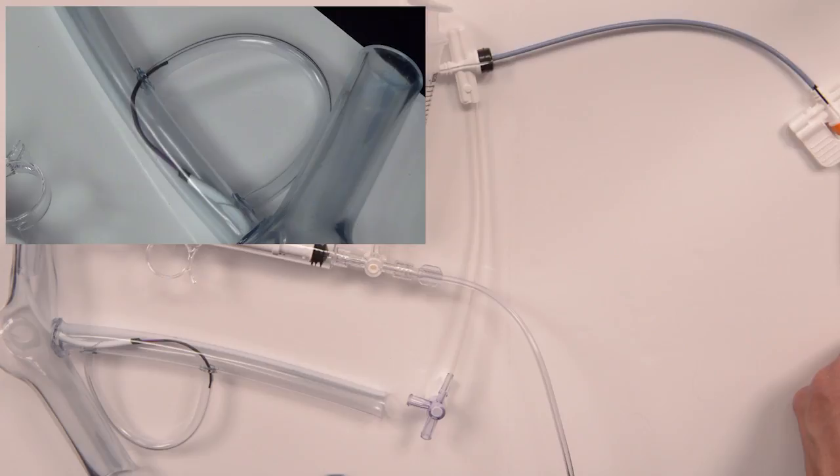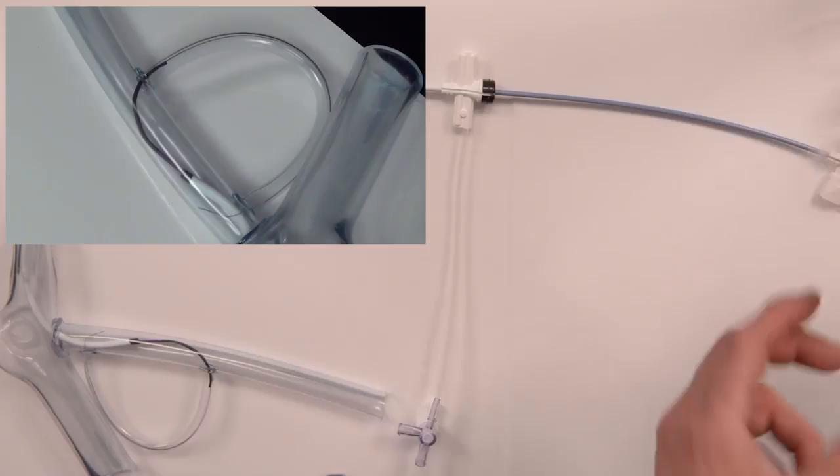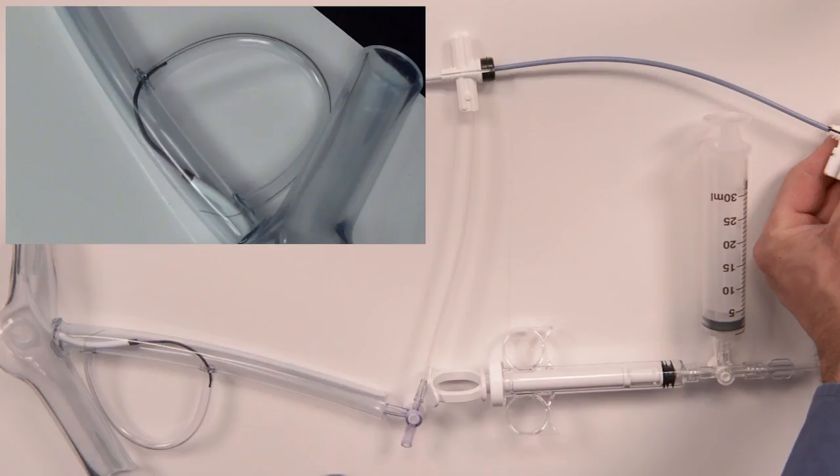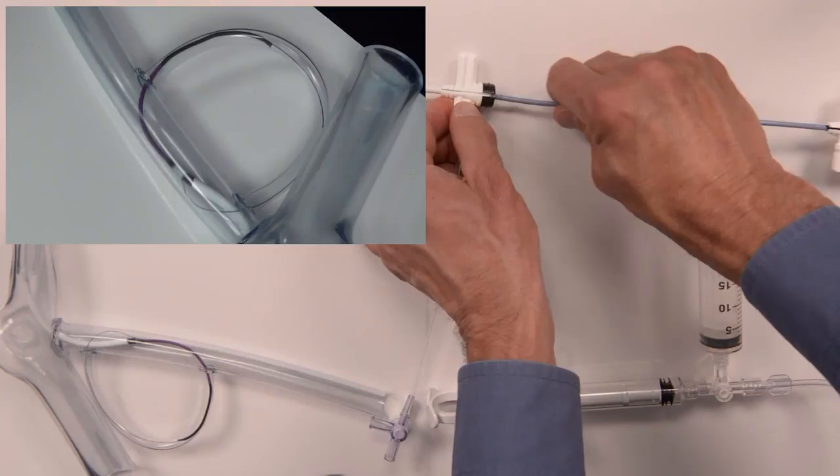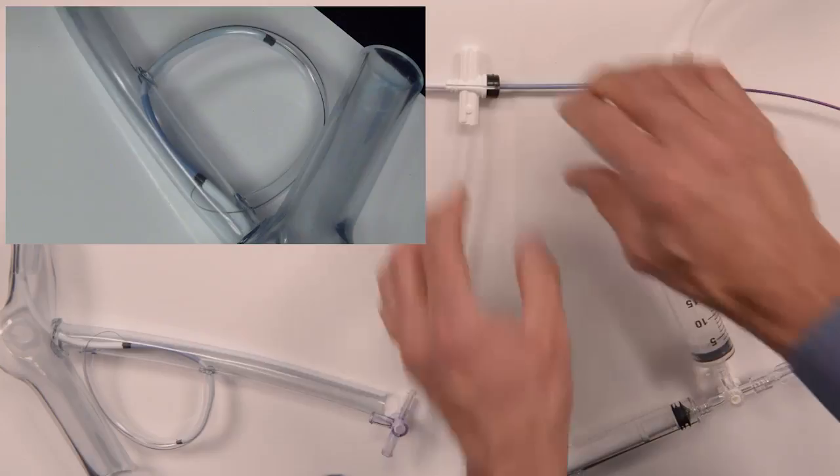At this point I'm going to advance the vein selector, which is going to track over that wire rail I've created, and it's going to go deeper inside that posterior branch. Now I have the vein selector tip as my rail, and I'm going to advance the LVI right over that very easily. It gave me a ton of support.